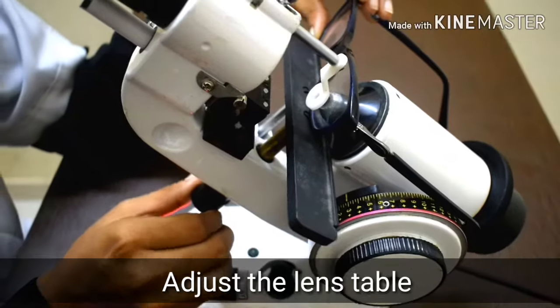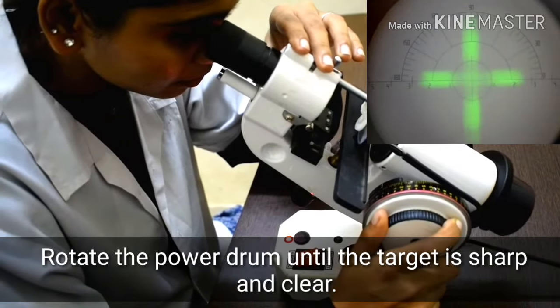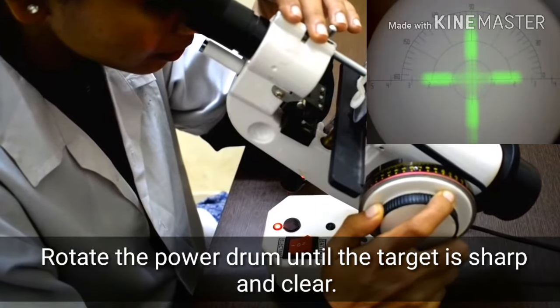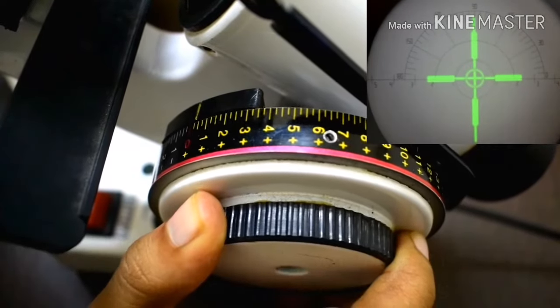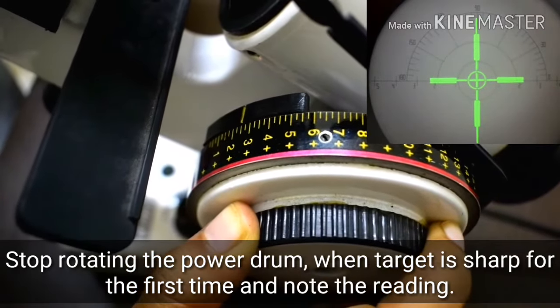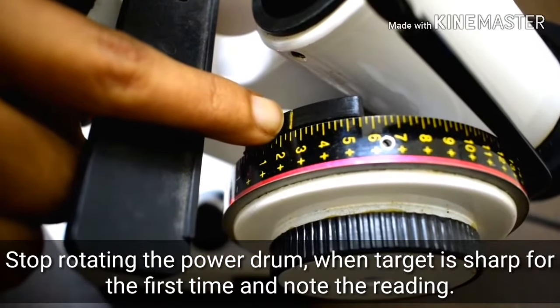Adjust the lens table. Rotate the power drum until the target is sharp and clear. Stop rotating the power drum when the target is sharp for the first time, and note the reading.